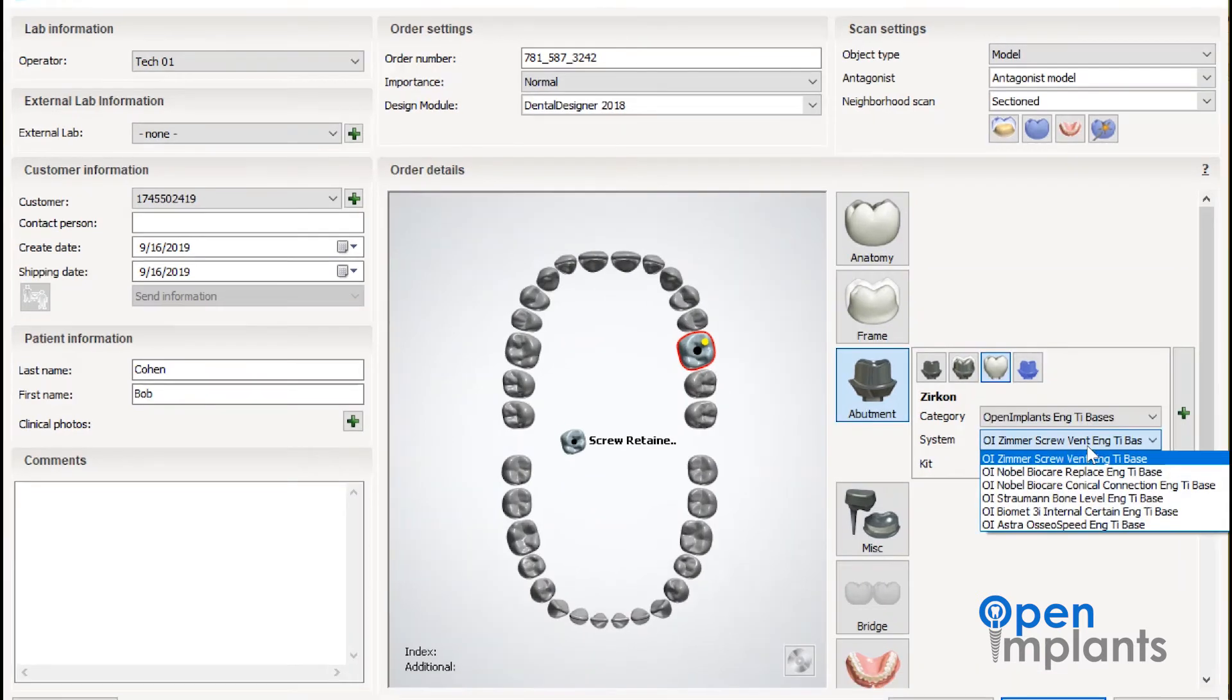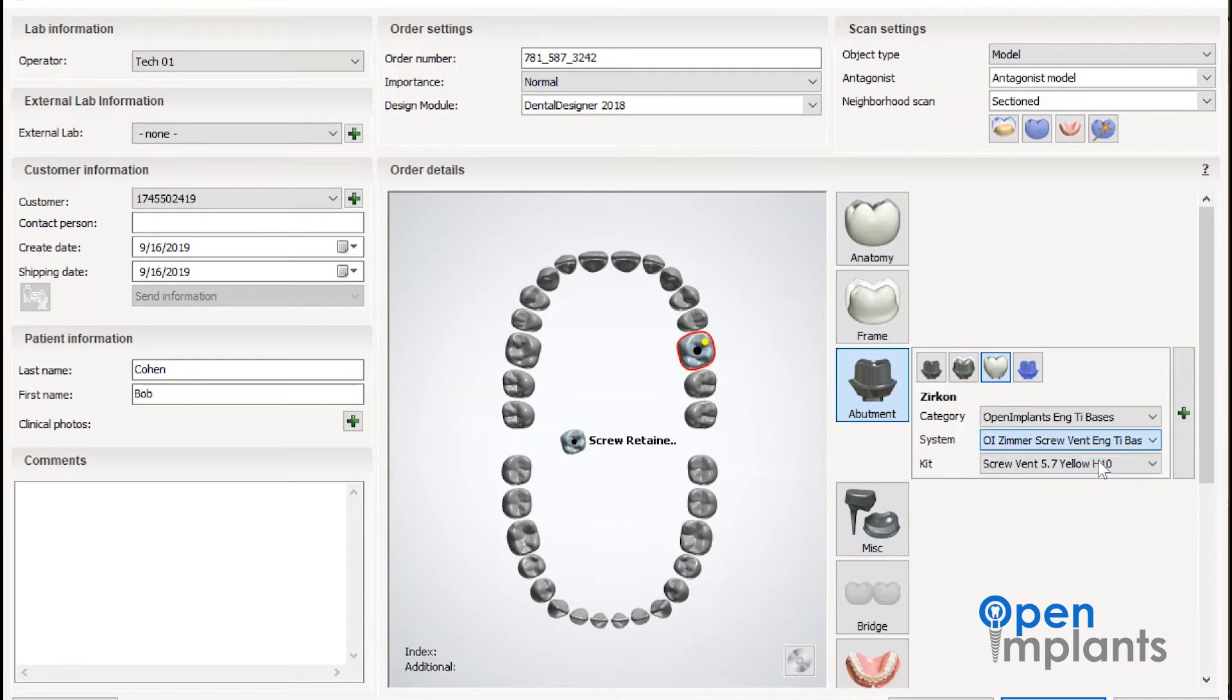Once the right category is selected, you're going to select the right implant system. We're going to use the open implant Zimmer screw vent library as an example today.